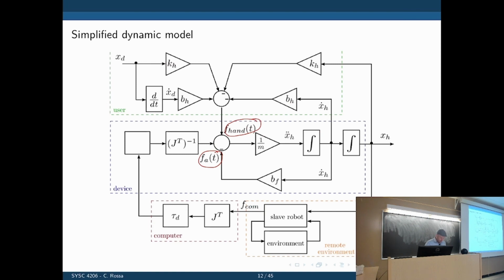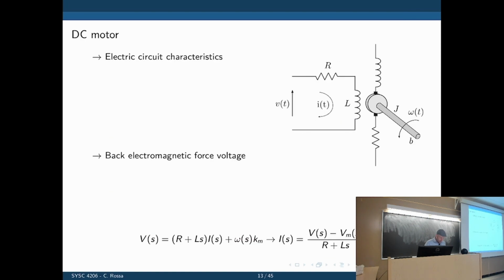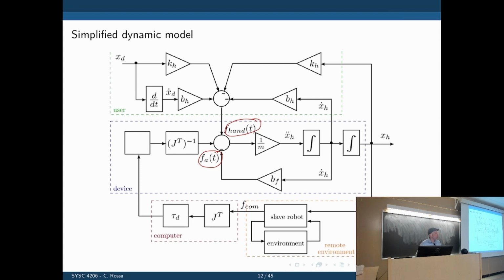If you wanted to do anti-gravity of the applied weights, would that be on the user side? That would be another thing implemented in the software here. So this torque coming up here would be the torque to create F plus the torque required to compensate for gravity.